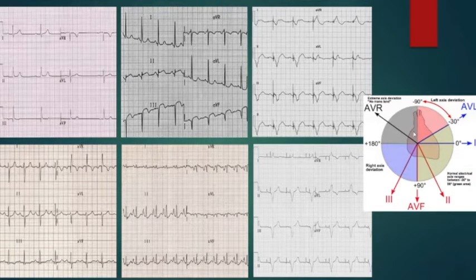So, what are we looking at next? The presence of P waves or not? The presence, you are almost right, because if there are no P waves present, then we have some rhythm disturbance and we have to define it beforehand. So we are looking at the P wave.